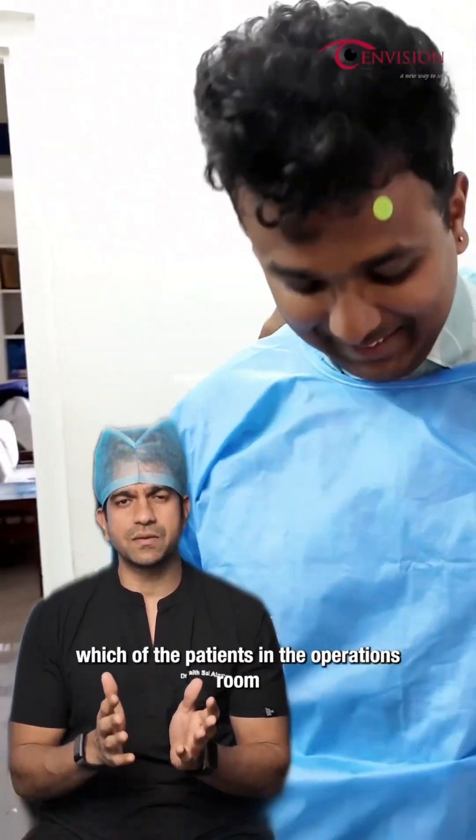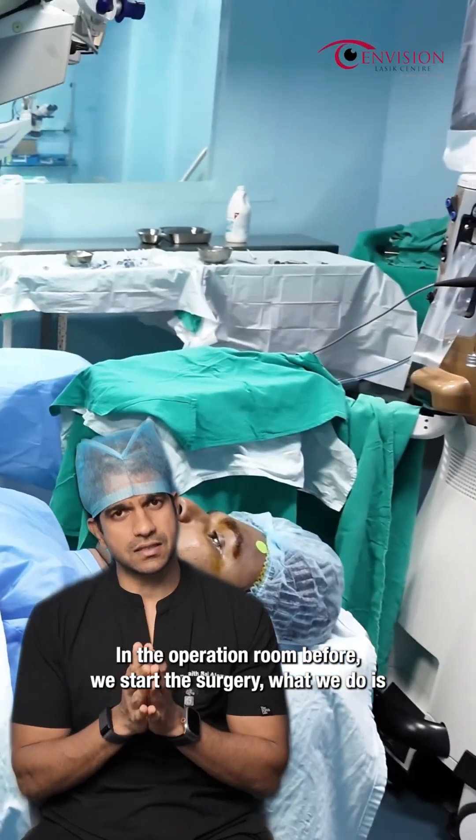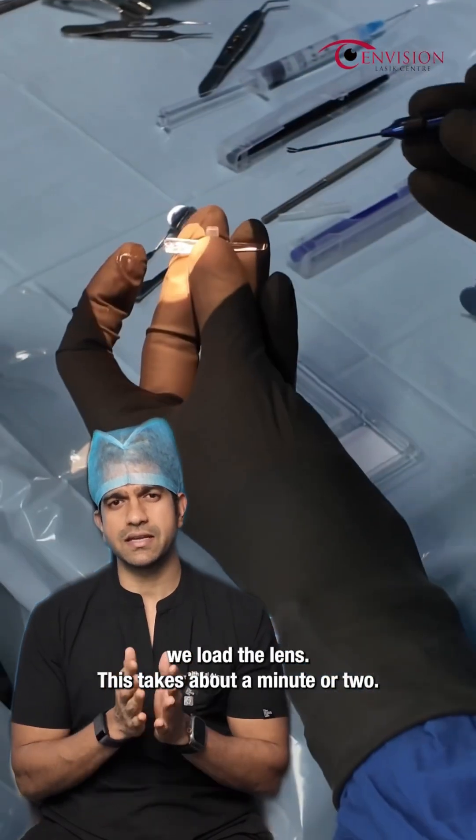Once the dilation is completed, we bring the patient to the operation room. In the operation room, before we start the surgery, what we do is we load the lens. This takes about a minute or two.